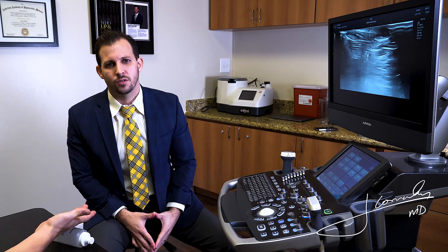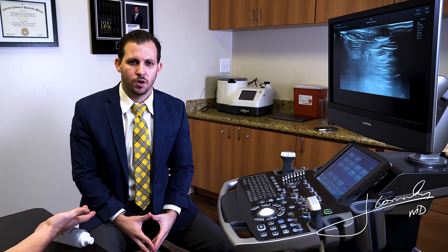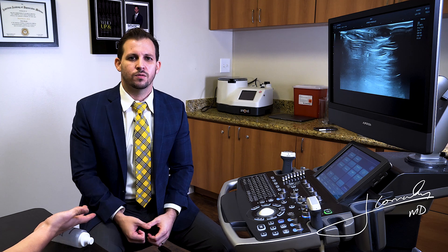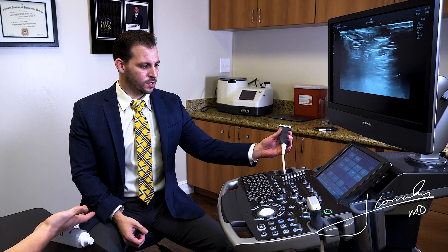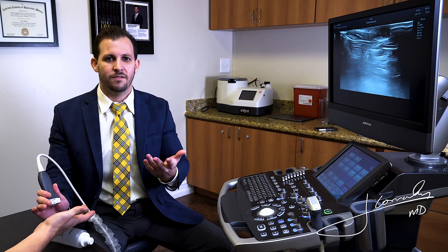Hello guys, today I want to show you how to do a proper ultrasound assessment of the trigger finger — what we call the flexor tendons of the hand that allow us to flex our fingers. Trigger finger is also known as stenosis tenosynovitis of the flexor tendons, the FDP and FDS.